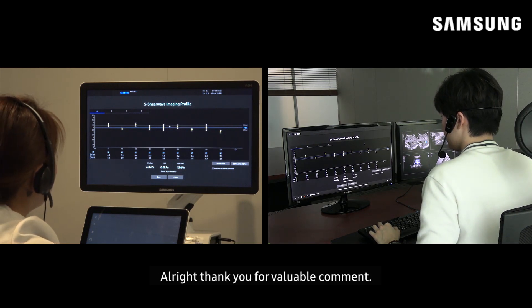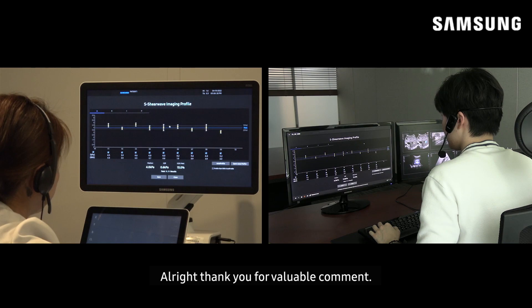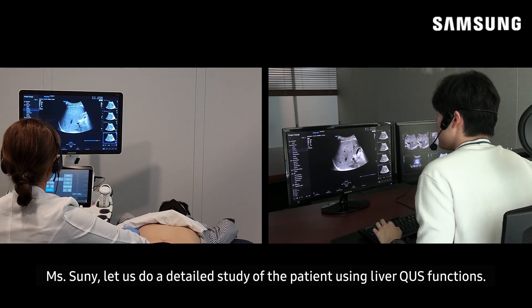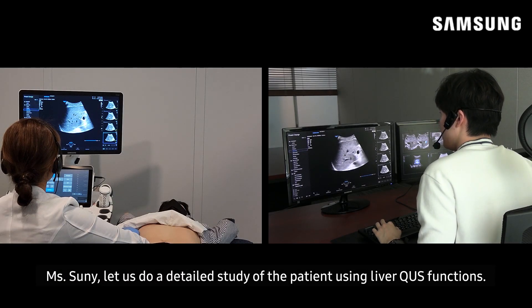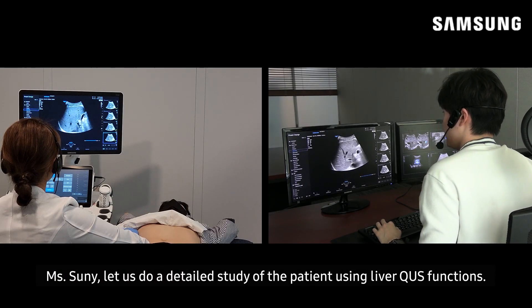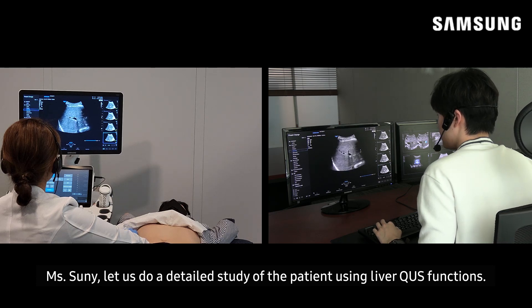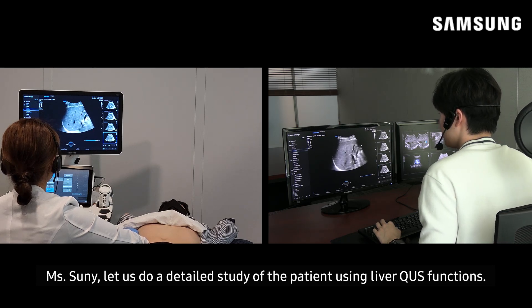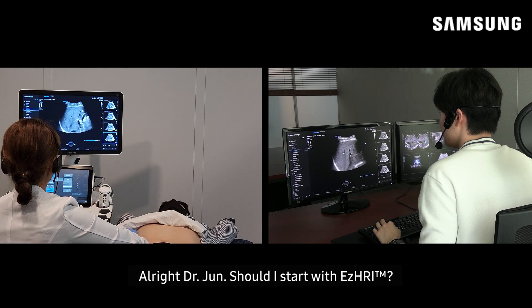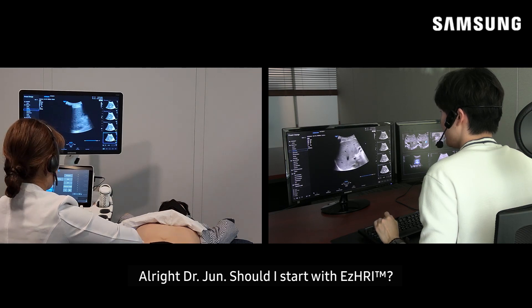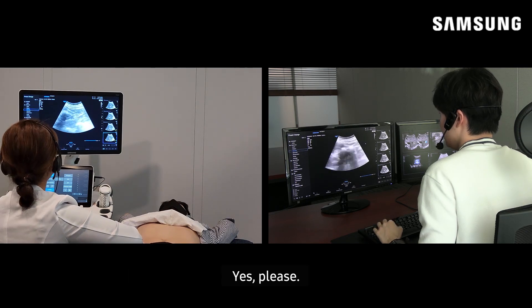Alright, thank you for your comment. Ms. Sunny, let us do a detailed study of the patient using liver QUS functions. Alright, Dr. Jun, should I start with EZ-HRI? Yes, please.